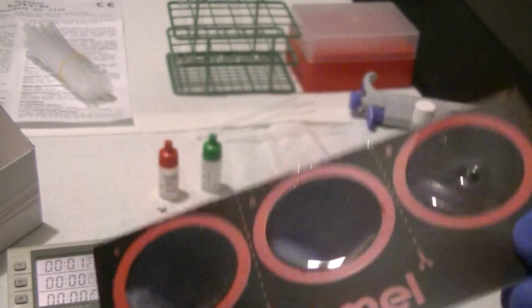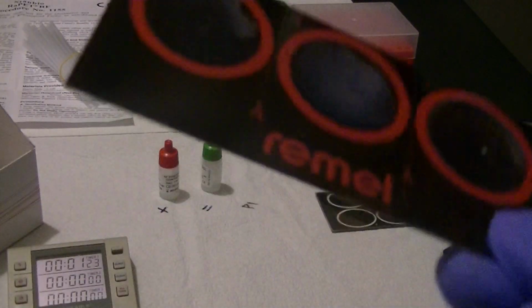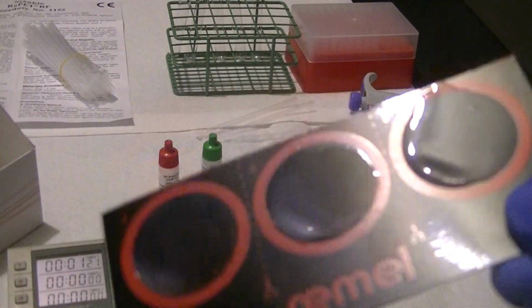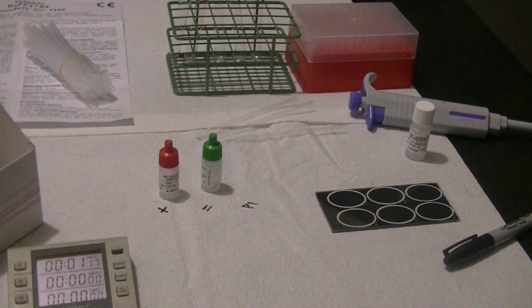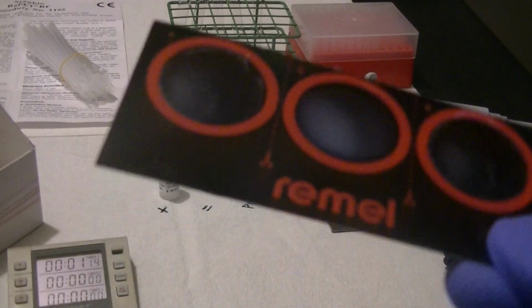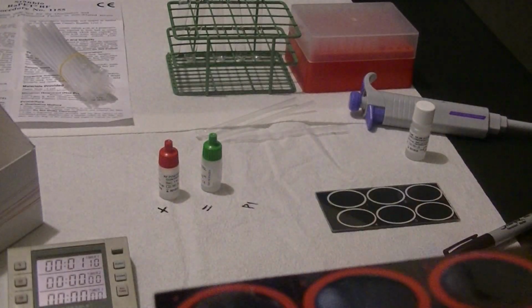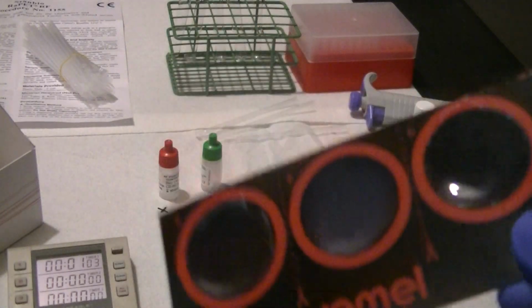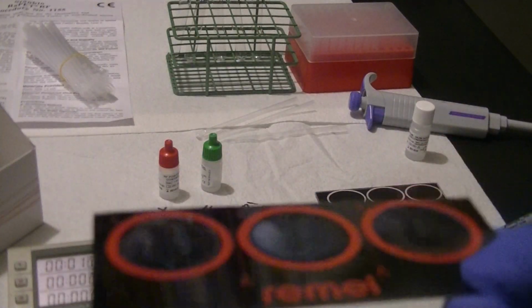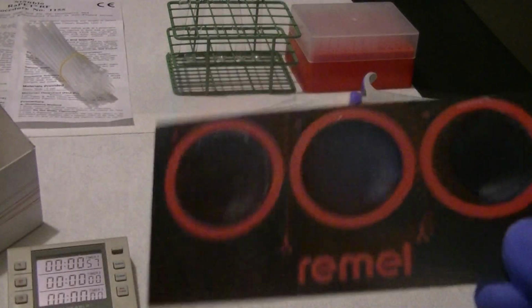Also notice that when I mixed the latex particle drop and the sample drop for the substance I'm testing, I made sure to spread those together and fill up the entire area of the circle, all the way to the red barrier or border. The reason for that is also so that we can easily see clumping of latex particles if and when that occurs. So we're simply going to rotate this card in our hands for 2 full minutes.